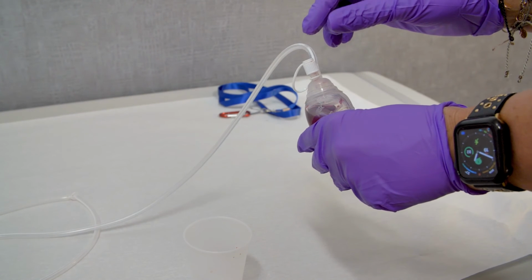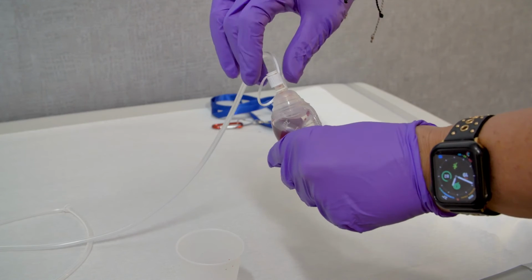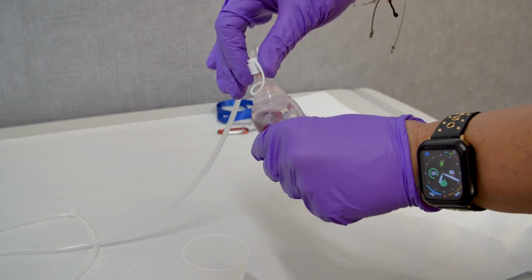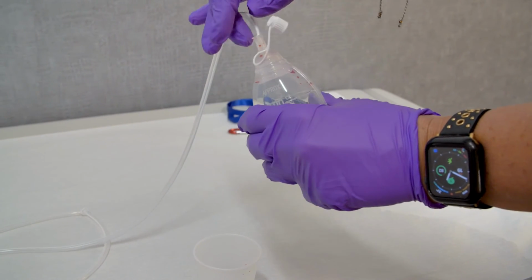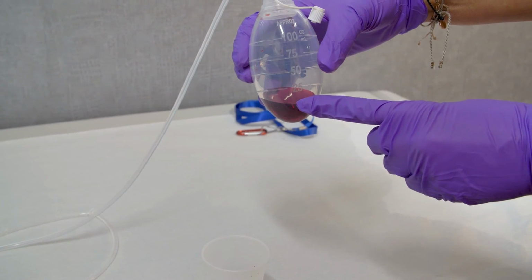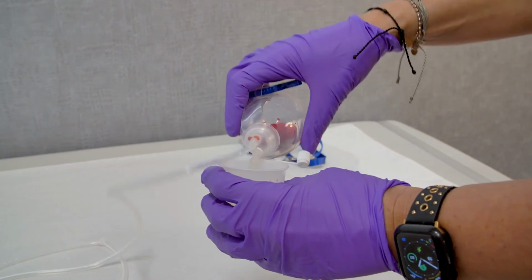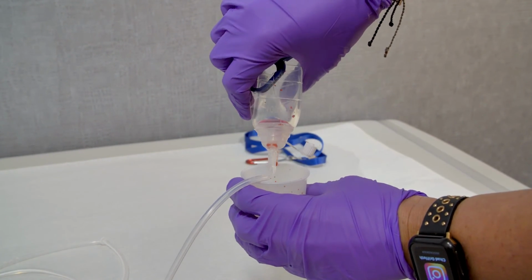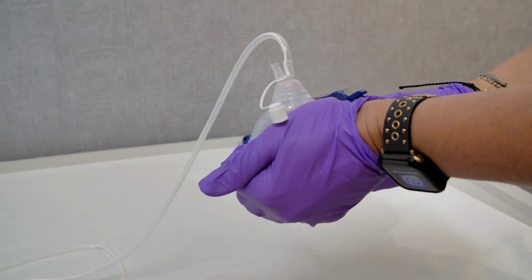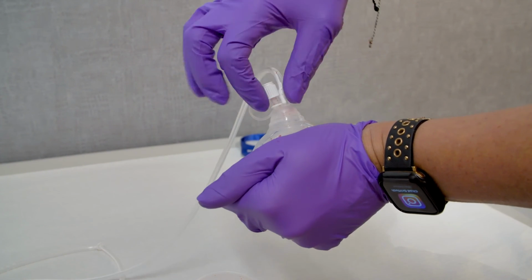Now, you may be sent home with a drain that has a different port. With this one, you're going to unscrew the top and gently let the bulb open. That is when you're going to look at the bulb and once again look at the numbers. There's about 20 cc's, and then pour it into the cup. Once again, you do need to squeeze the bulb tightly back together to engage the suction and then screw the top back on.